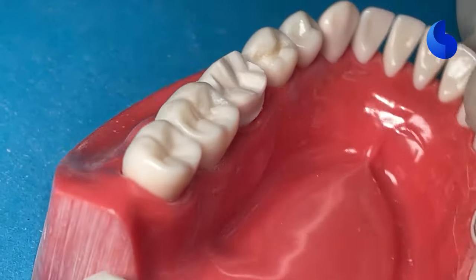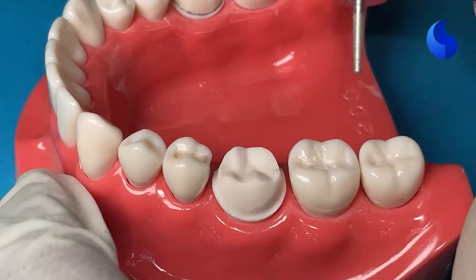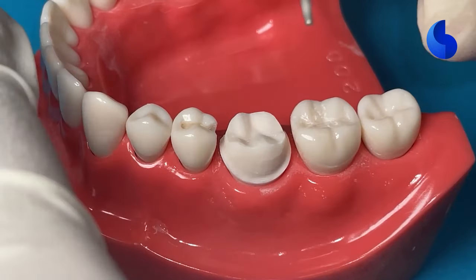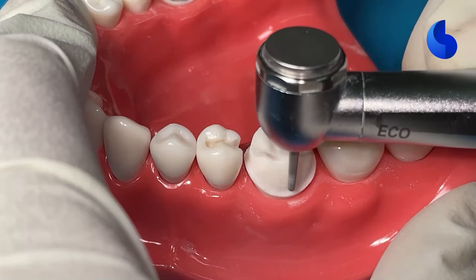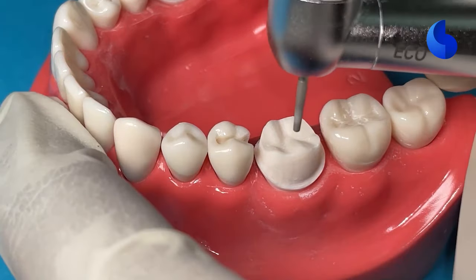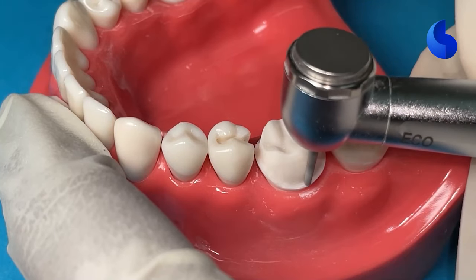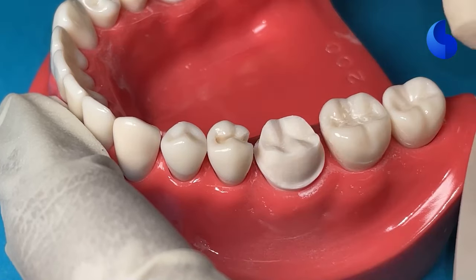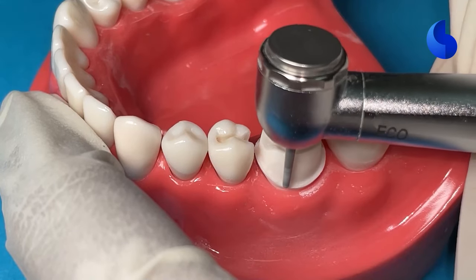And once you've created that beautiful margin around the entire preparation, you can switch to a slow speed handpiece with a finishing burr, the same 856-016, but a red stripe, so that you can remove the fine scratches on your tooth structure, which can easily be removed by using a finishing diamond in a slow speed burr. So you can move along each surface, starting from the buccal and go to your proximals, your lingual. And also, we'll do it on our occlusal surface to remove any sharp edges.